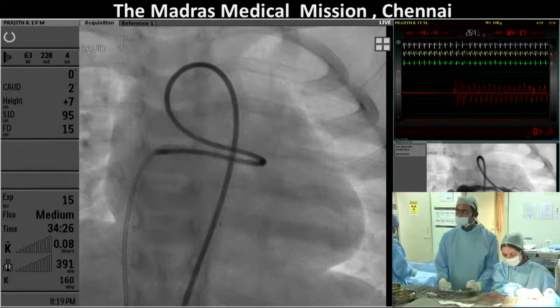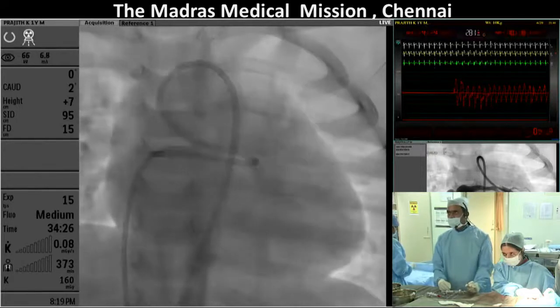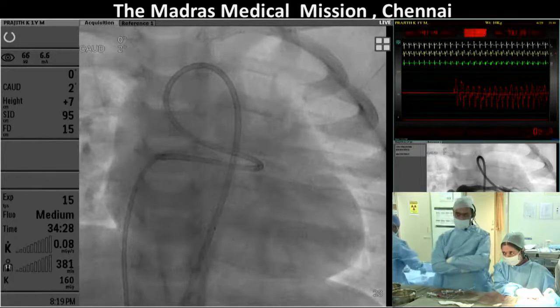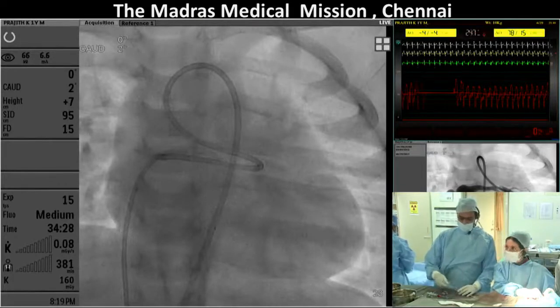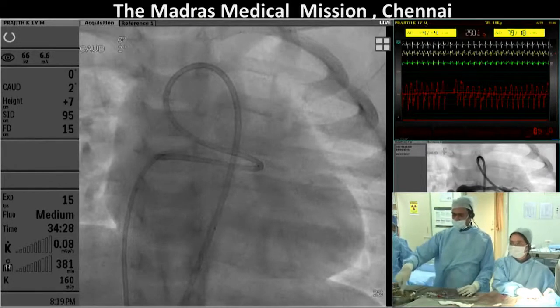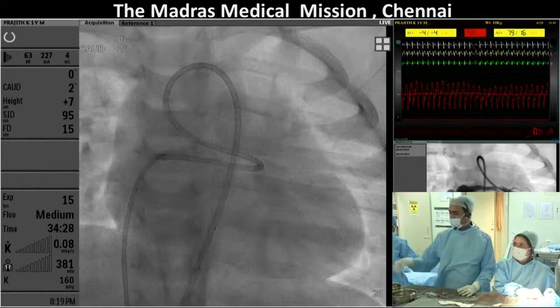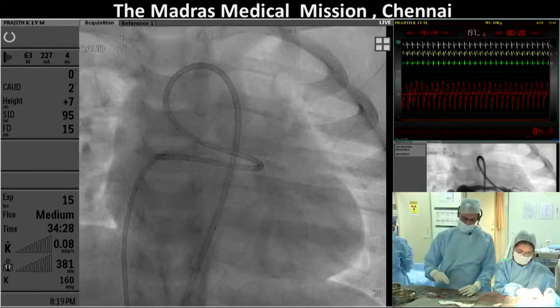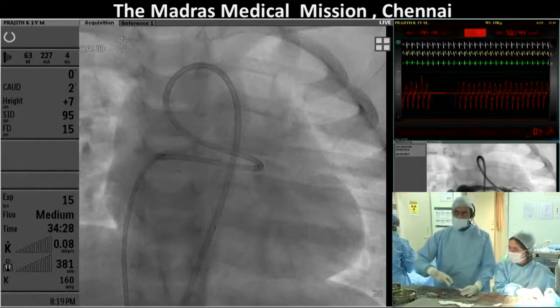It will get thrombus, and it can cause thrombus propagation into the coronary arteries. So you have to close from both sides, or? No, that is one thing that can happen. But many times you see that some of these arteries can remodel, especially in smaller kids. And we have seen that a tiny sinoatrial branch can still be maintained if you close the fistula distal to the origin of that branch.